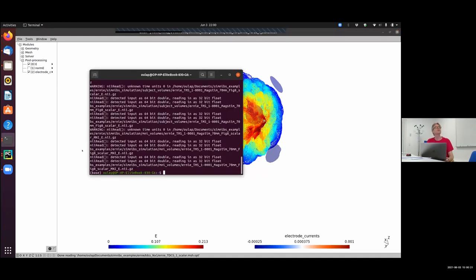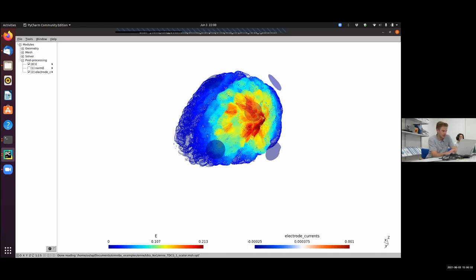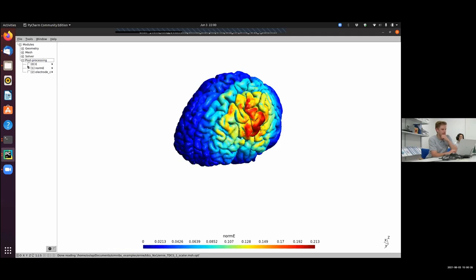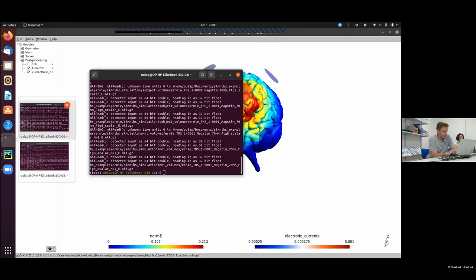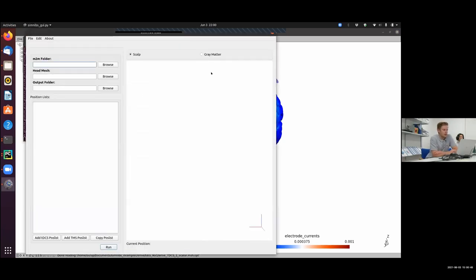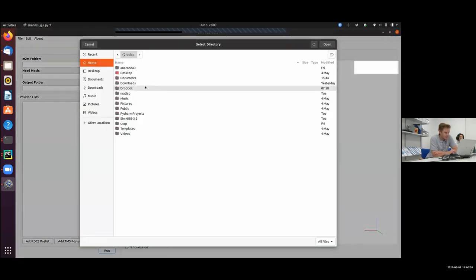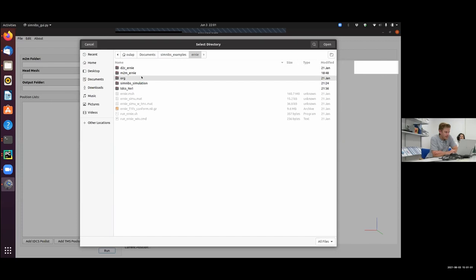Oula can quickly show that. He's now taking over again. Yes, thank you. So this was just a 4x1 montage. This was actually quite a big cross that we simulated here. But it's basically the same as before, but now with a different montage. Good. And conductivities. Which one am I on now? I rarely use the GUI. It just opened with some head mesh and planned some montage.